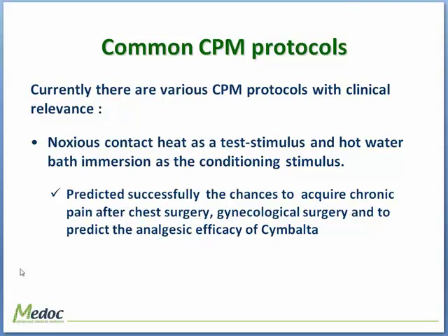CPM, they would not get benefit from Cymbalta, but those who are deficient would benefit, since they have less and there's something that the drug can restore. Okay, so let's go to the next protocol.